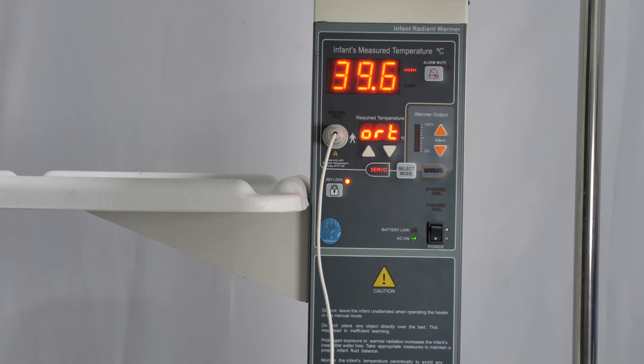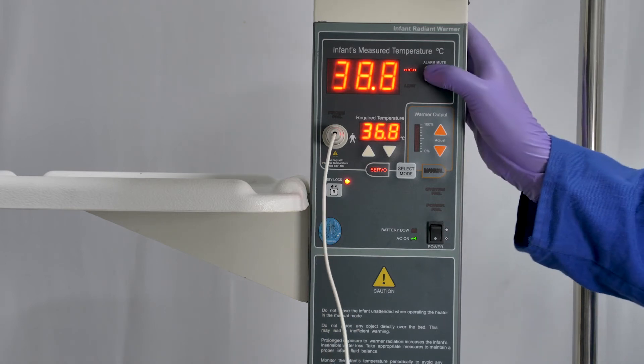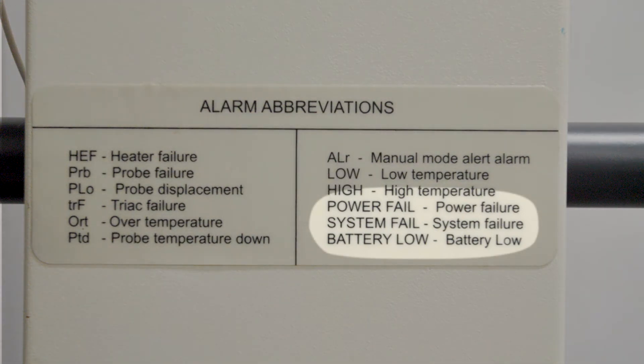In servo mode, if the temperature is too high, you will get the message ORT for over temperature. If this happens, you need to investigate why — is the probe properly attached to the baby, or is the baby too hot? There is a button to mute the alarm; you may need to use this sometimes while you are setting the machine up and the probe is not yet in place. There is a list of abbreviations for different alarms attached to the machine. The machine will warn when the battery is low or there is some other technical problem causing a system failure, in which case you need to contact the maintenance department.